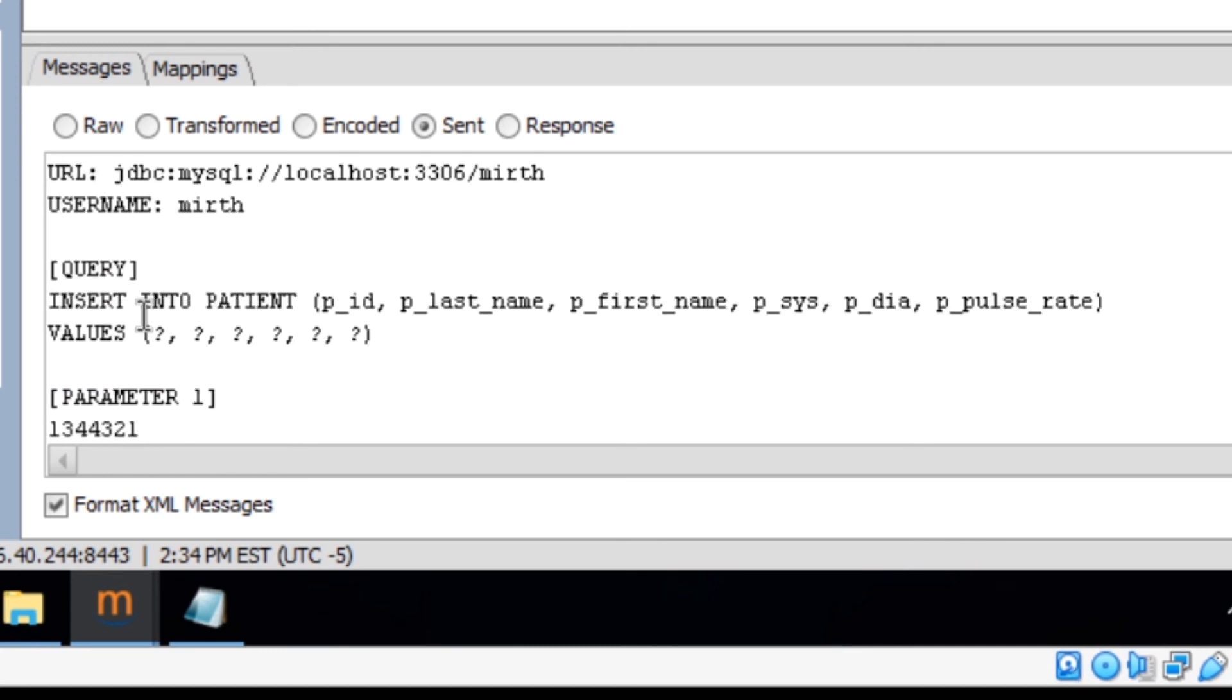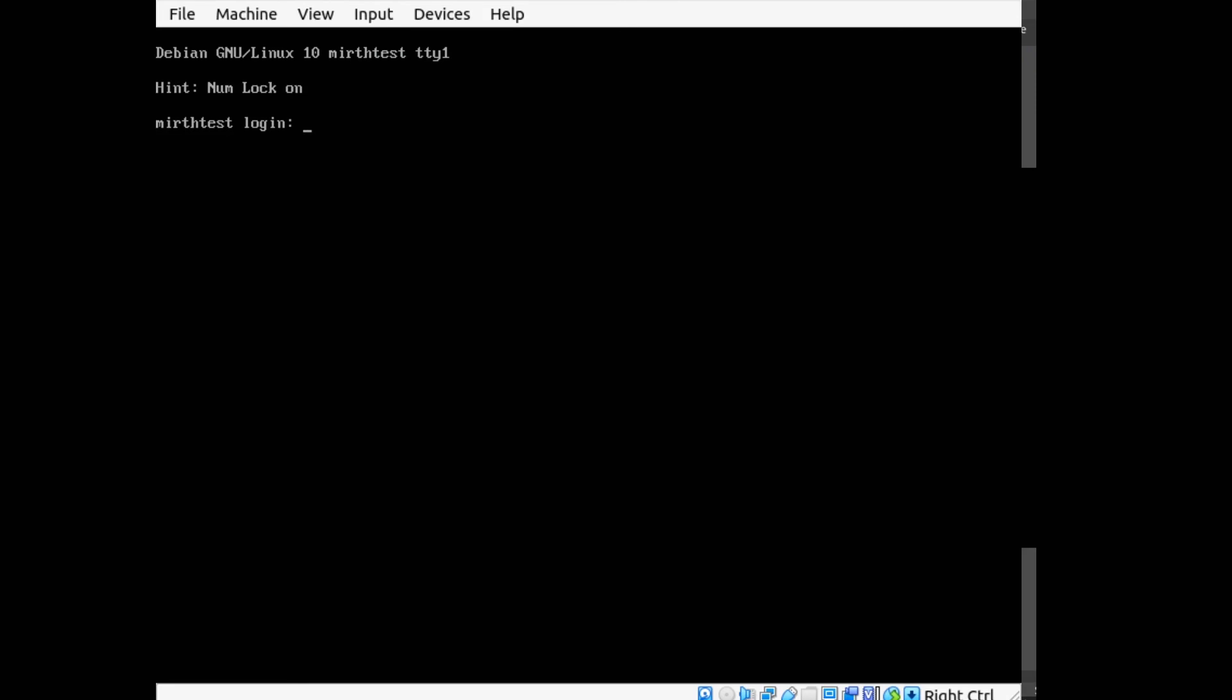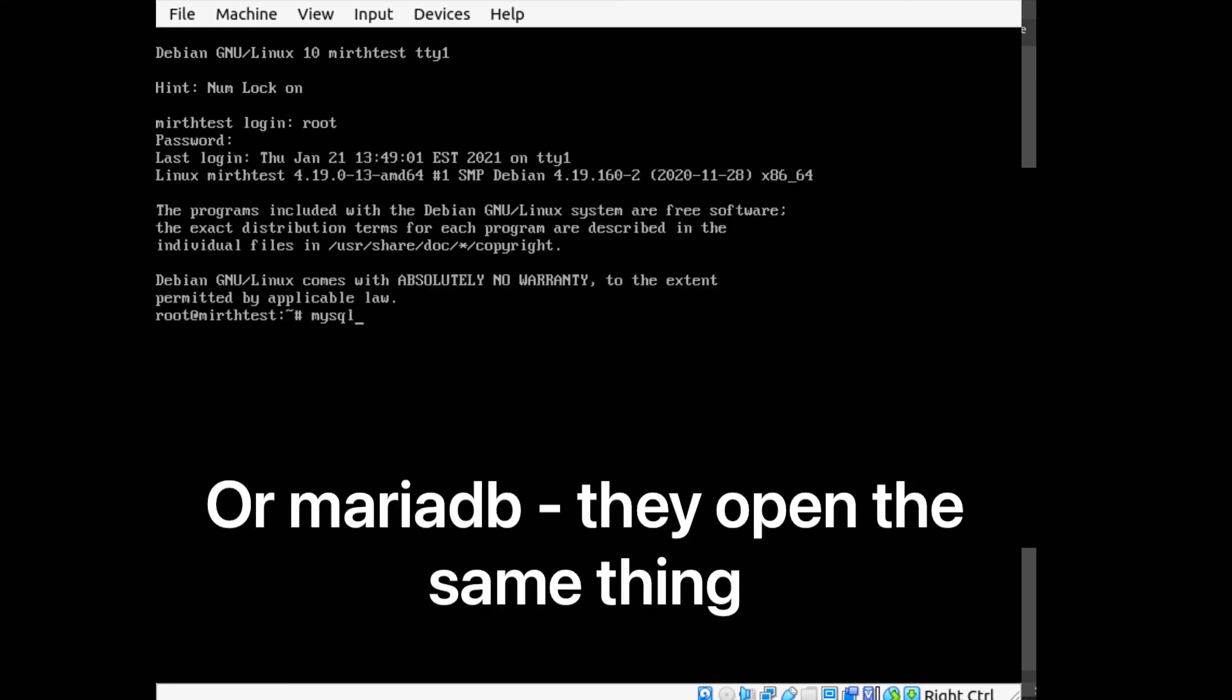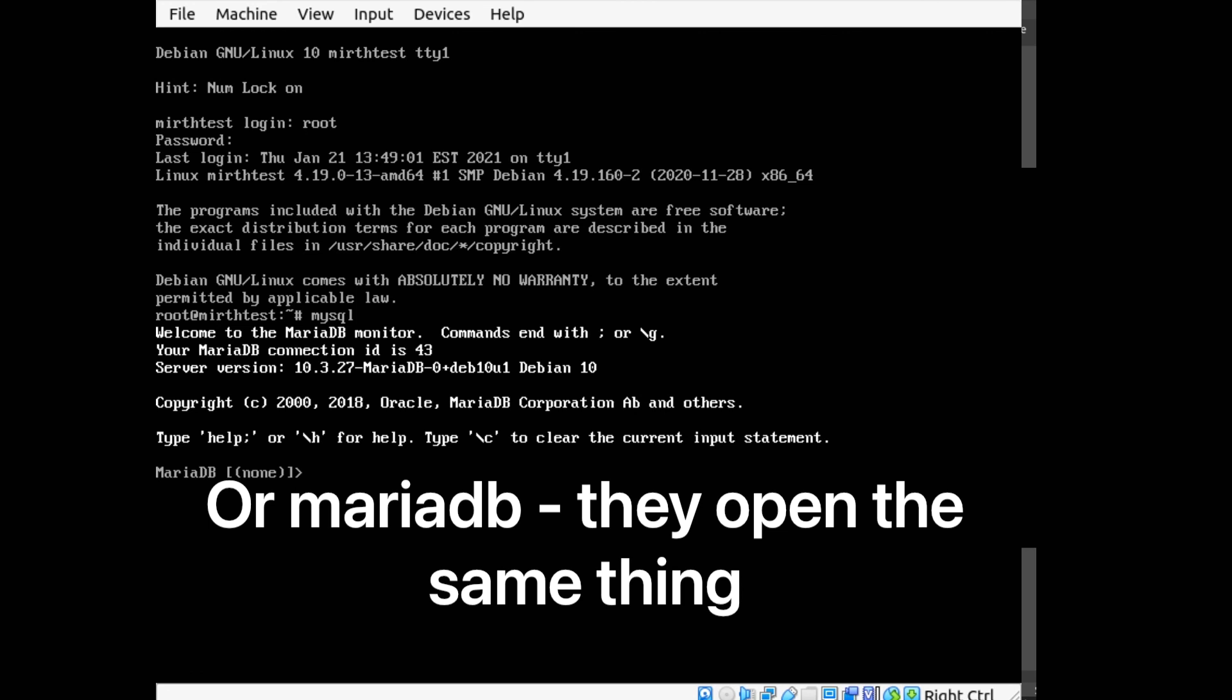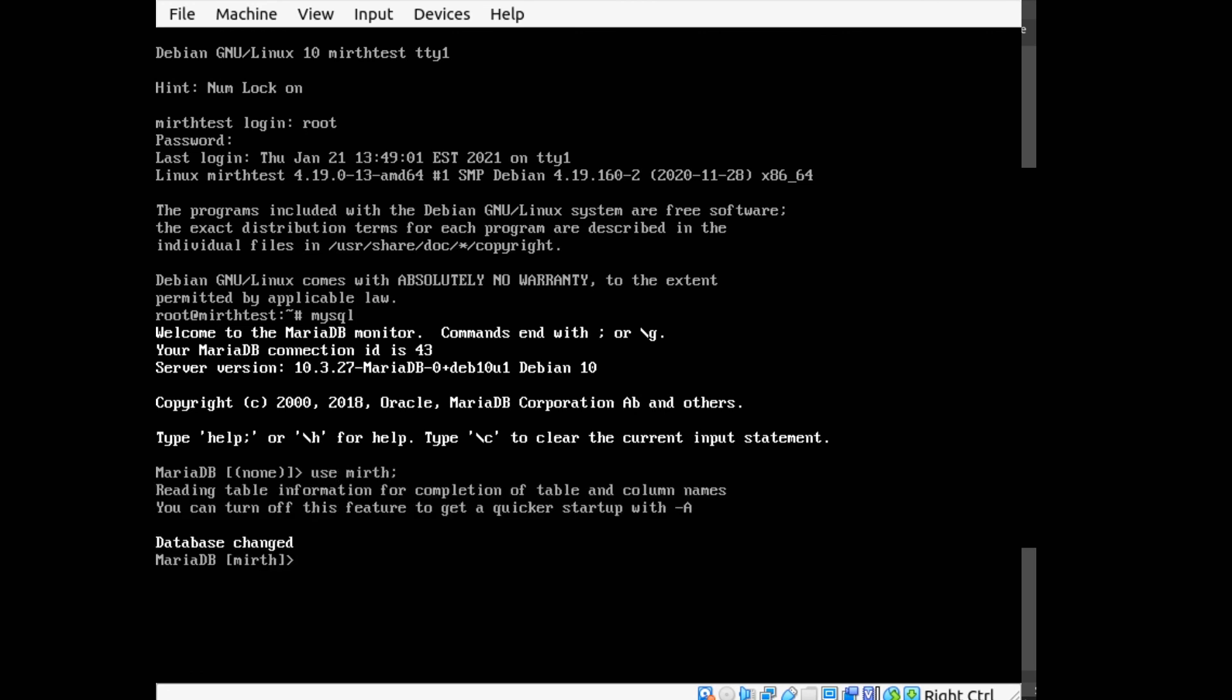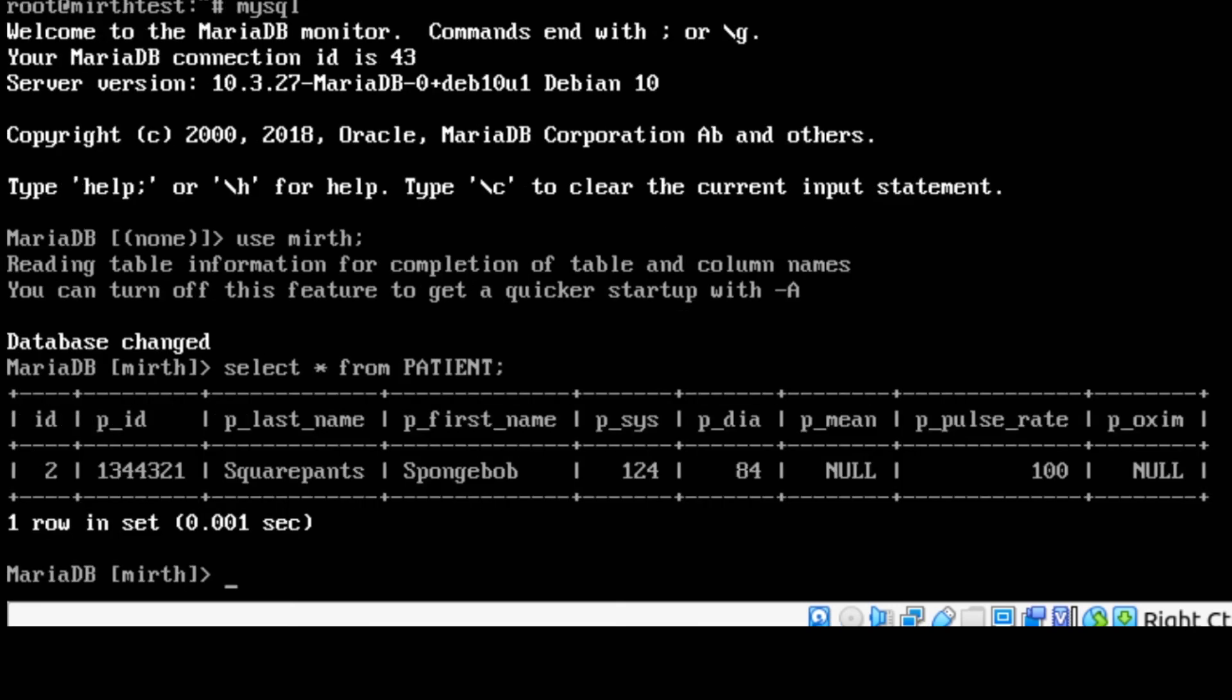So now what we can do is we can go back to our Linux server and see if it actually did get it. Okay so now I'm back here with my Linux server. I'm going to log in as root and then open up MySQL. And I can do use mirth to select the mirth database. And now I can do select star from patient semicolon. And you can see here that we now have one record in our database with the values from the HL7 message we just sent.